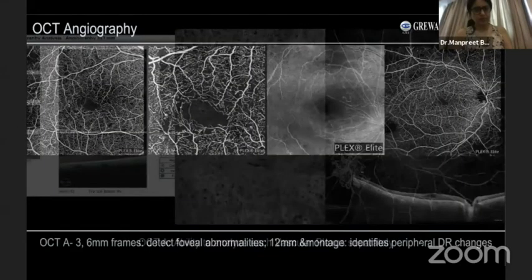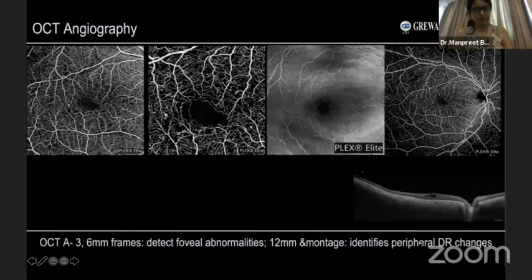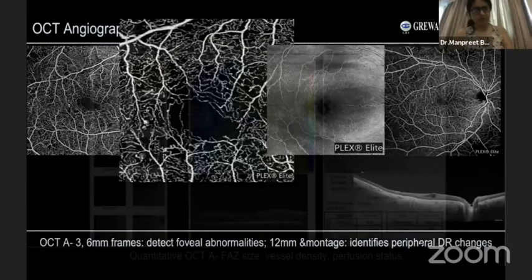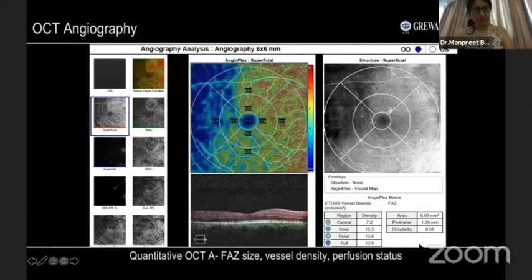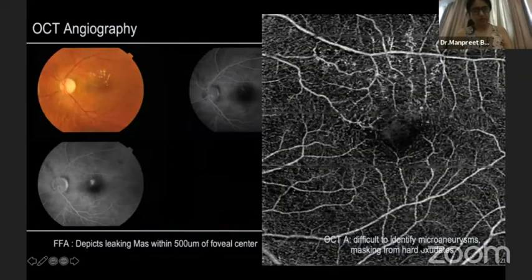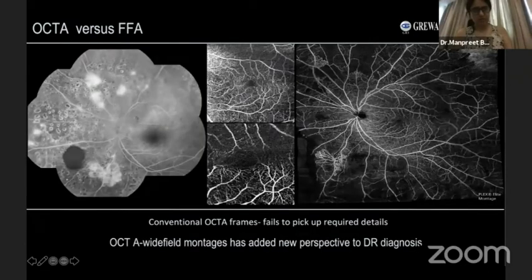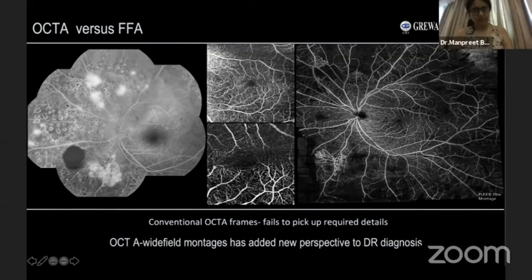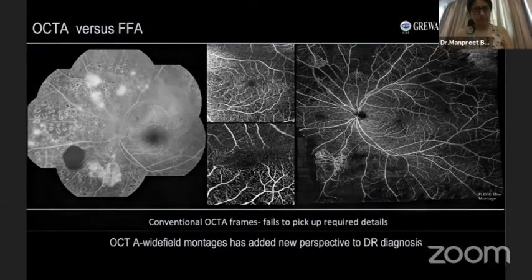The conventional OCTA images capture only the 3mm and central 6mm scans. The quantitative OCT parameters also help understand diagnostic logistics. In the case of a PDR, conventional standard OCT frames will not pick up required details, but OCT wide-field montages show complete details and add a non-invasive diagnostic modality to identify PDR cases.